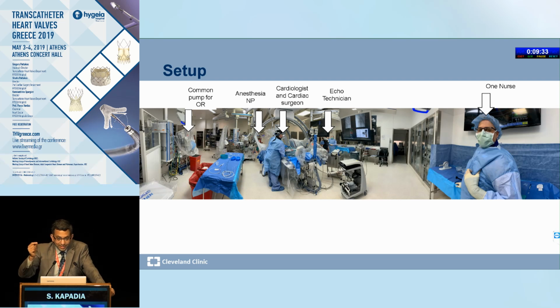This is on a floor where there are all the ORs. So we have about 15 operating rooms. And for all operating rooms, there is only one pump, which is primed and ready for extra use. So this is a pump that resides in this particular room. So this pump is ready and available. Our goal is that if you have a complication, within 3 to 5 minutes, we said 3 minutes, but maximum 5 minutes, we should be able to provide whatever need be.